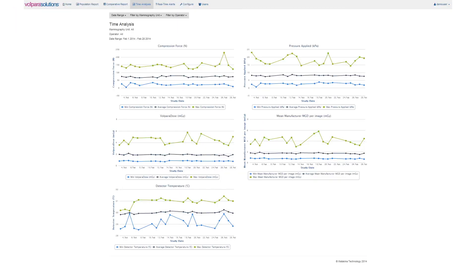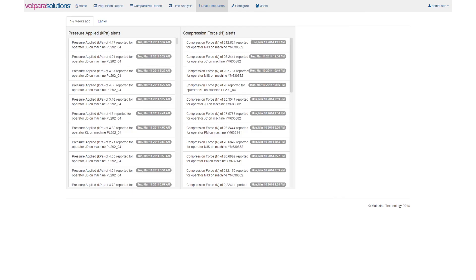Data can also be displayed over time to better visualise trends and maximum values. The time analysis displays variables by X-ray units and operators, which can be filtered. Some of the maximum values could be an area to investigate. Users can configure alerts for when dose, force, and pressure thresholds are exceeded, and these are listed in date order on this tab. Alerts can also be emailed to recipients.